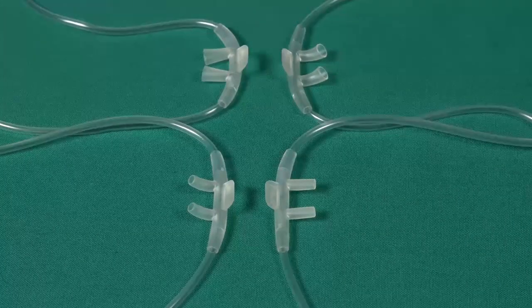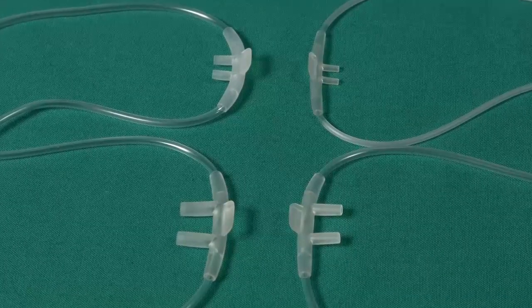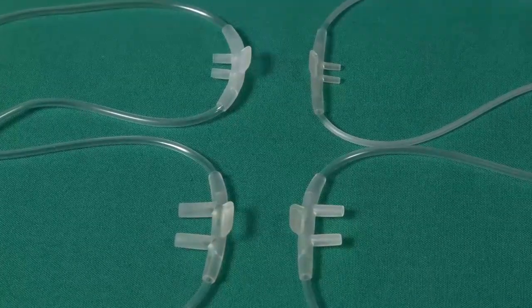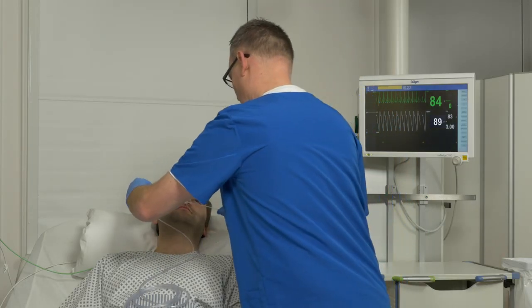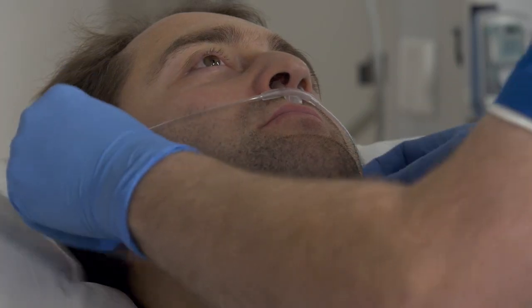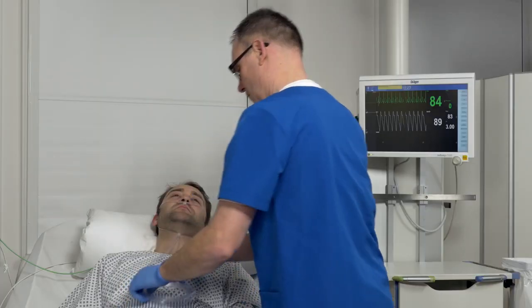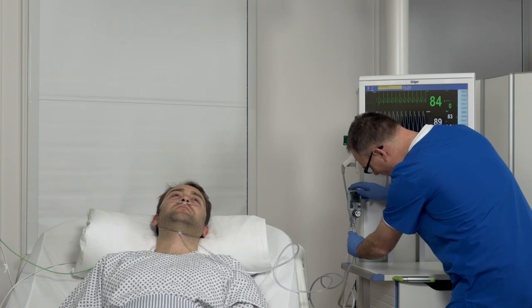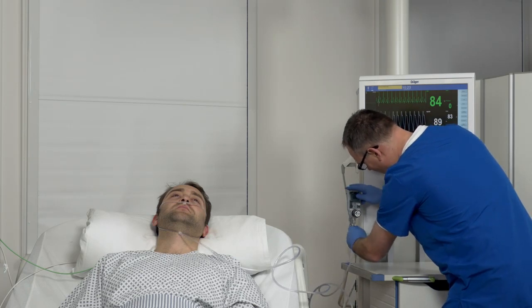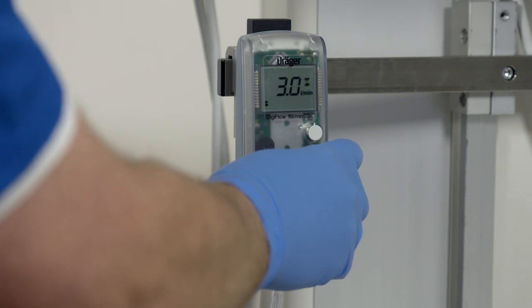Nasal cannulas are available in four different shapes and four different sizes, and can be adapted to ensure the right fit for any patient. The nasal cannula is connected to the flowmeter with the attached oxygen hose. The hose is placed over the ears and brought forward to the nostrils without needing to lift the head. Depending on the size of the patient and the selected nasal cannula, a gas flow between 0.125 and 6 litres per minute can be selected. Refer to the instructions for use for the corresponding values.